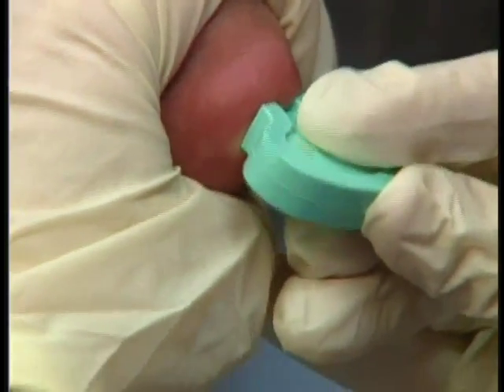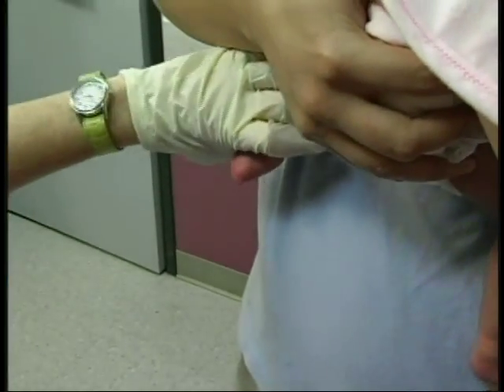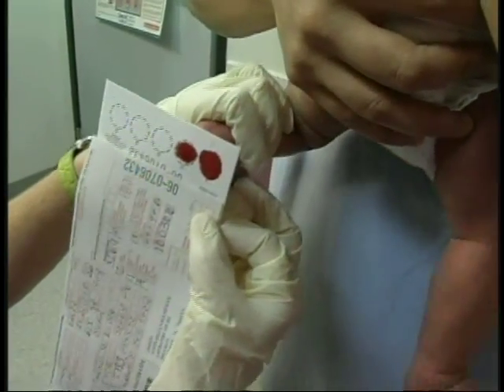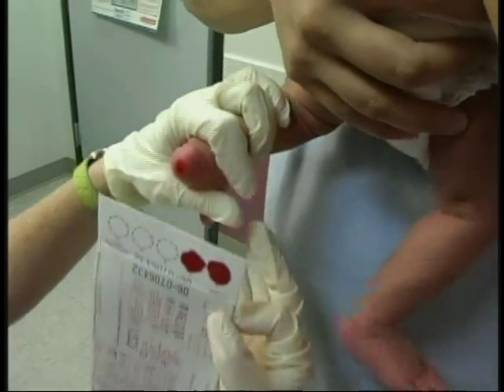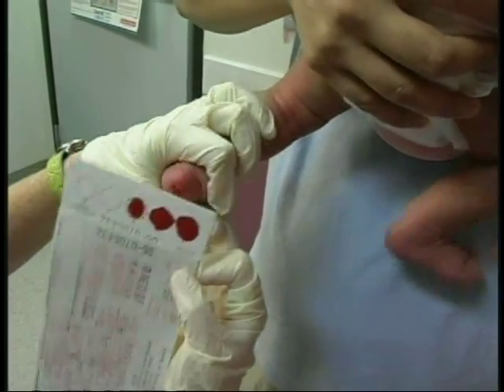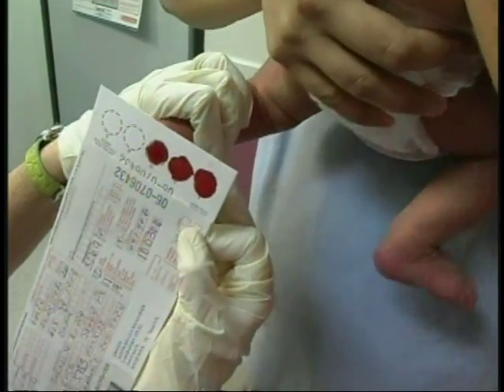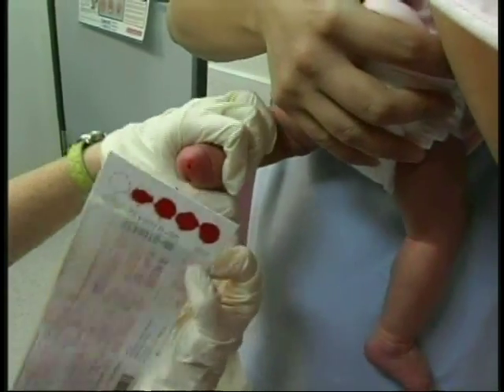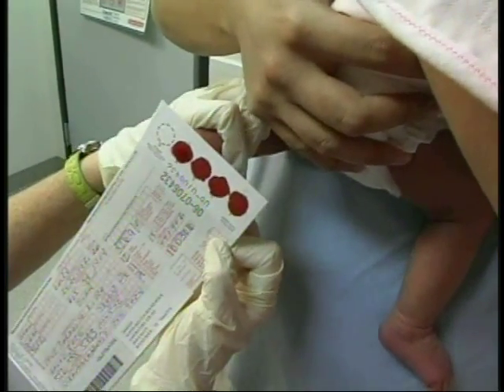Puncture the heel and wipe away the first drop of blood with sterile gauze. Allow another large blood drop to form. Lightly touch the first circle on the filter paper to the large blood drop. Allow the blood to soak through and completely fill one circle at a time. Apply blood to only one side of the filter paper. Avoid having anything but the blood drops come into contact with the circles. To enhance blood flow in order to fill the circle, you may apply very gentle intermittent pressure to the area surrounding the puncture site.